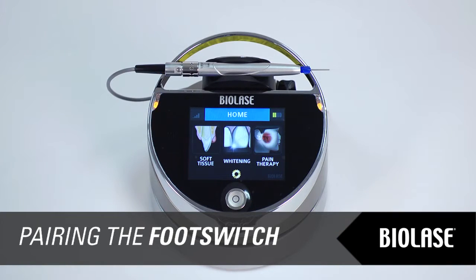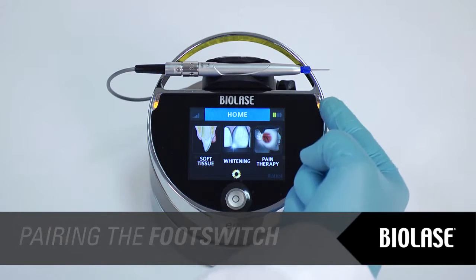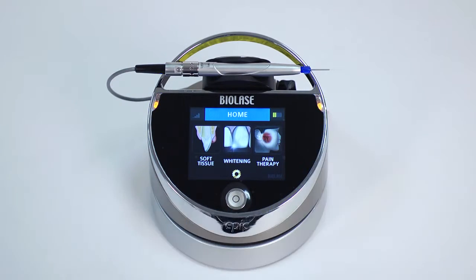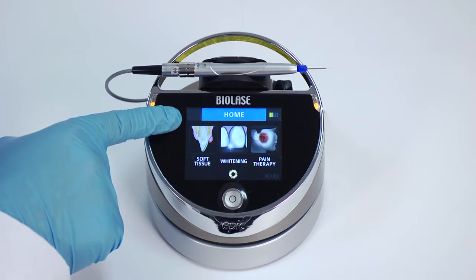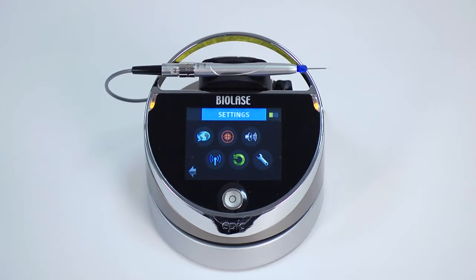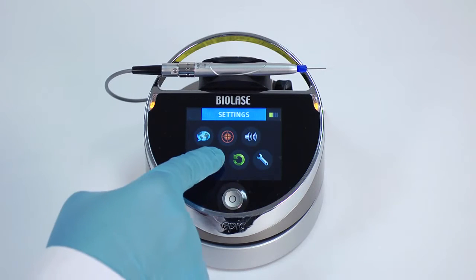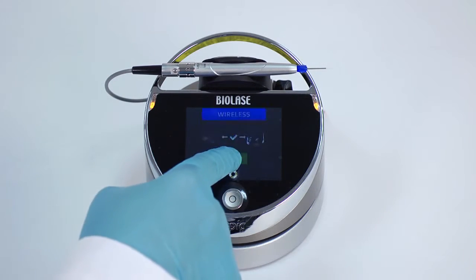To verify that your EPIC and foot switch are paired, there are 2 visible indicators. 1. Blue LED lights on the laser will blink. 2. The wireless signal strength indicator. If wireless communication between your EPIC and foot switch is not present, tap on the settings icon in the bottom center of the home screen. Next, tap the wireless icon. A screen will appear indicating that pairing of the foot switch to the laser console has been lost. Press the green Pair button to begin the pairing process.